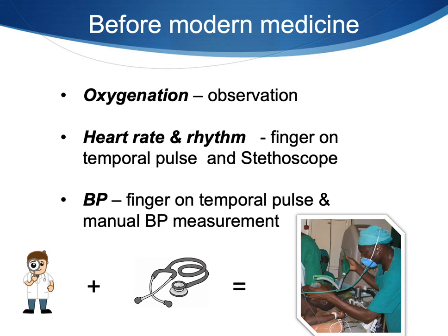Out of all of this came the precordial stethoscope. The precordial stethoscope could be placed on the chest and left there, listening to breath sounds, and there would be a stopcock in the tubing that can then switch so that they could determine the blood pressure.